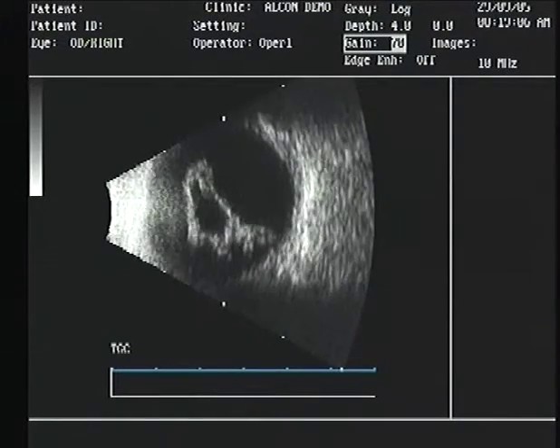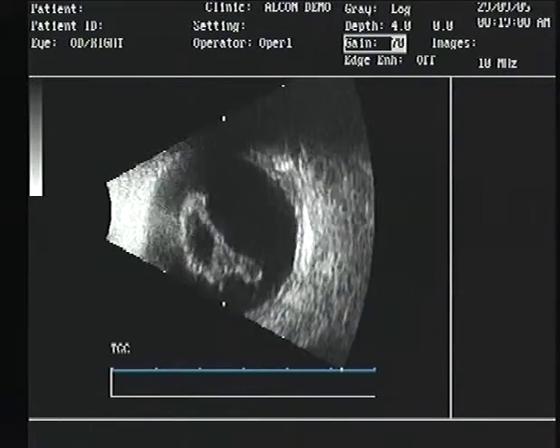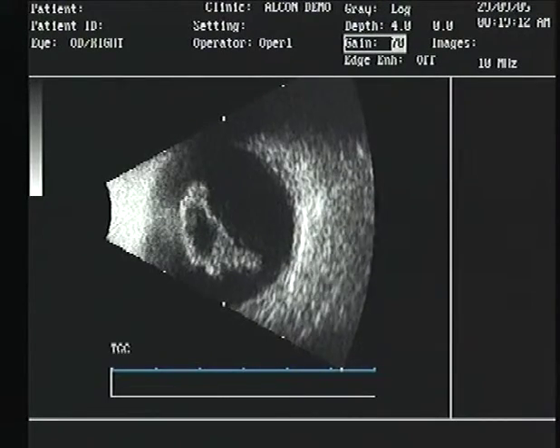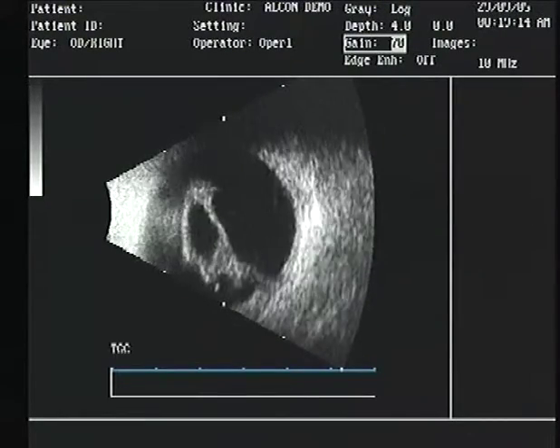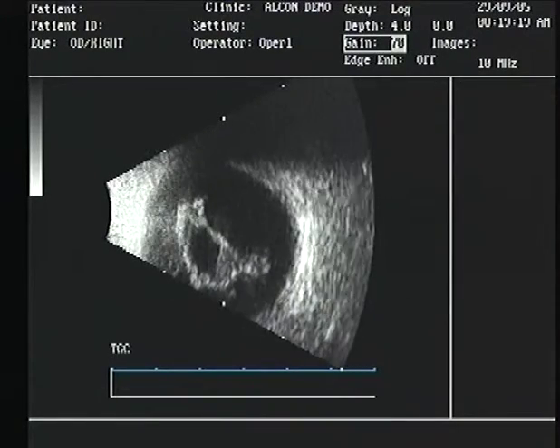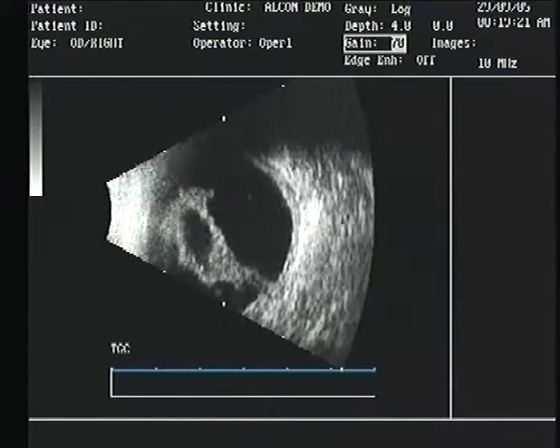This is precisely the sort of thing I was looking for. This is a diabetic patient with a dense cataract. He has a total trumpet detachment, and any cataract surgery would be quite pointless.